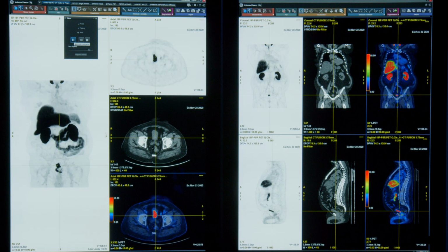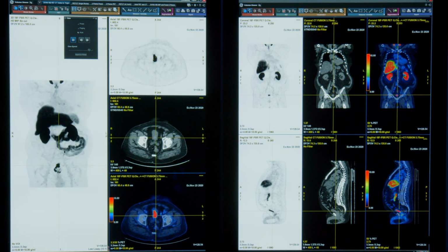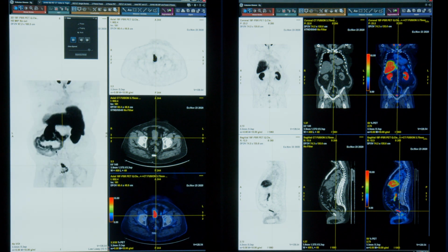digital rectal exam. So these patients in Australia, the gold standard for them is to go and have a multiparametric MRI to image the prostate and look inside the prostate for any abnormalities. The trial involves the patient having a PSMA PET at the same time as the MRI.